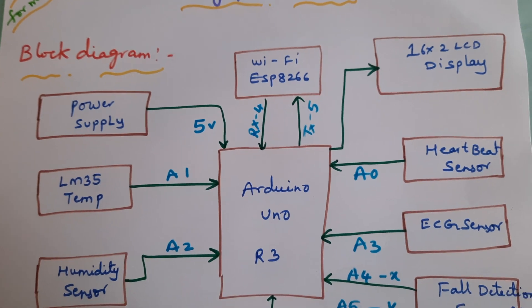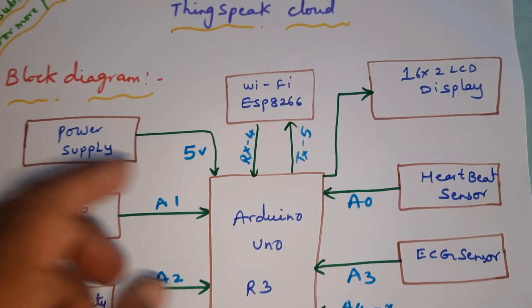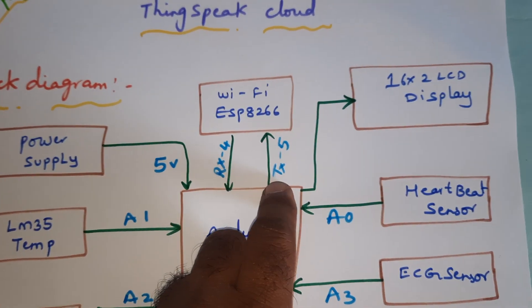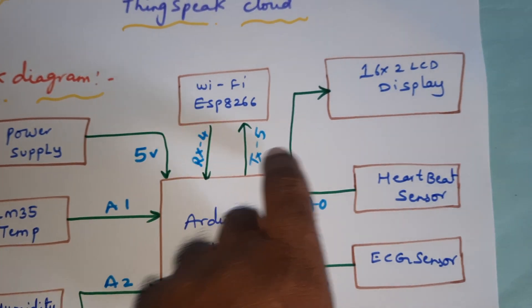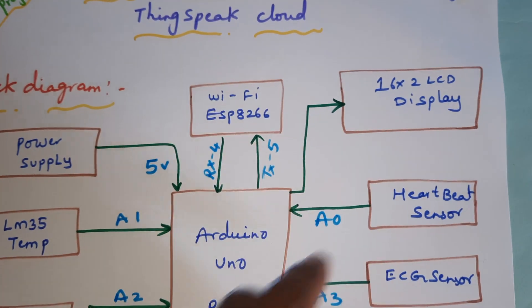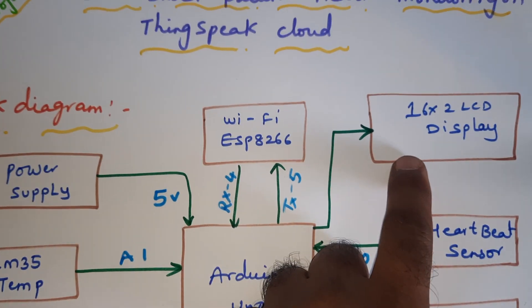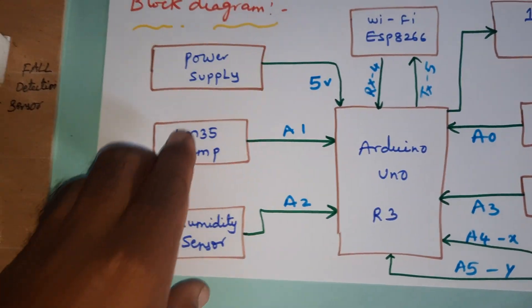The WiFi ESP8266 is connected to RX pin 4 and TX pin 5. The 16x2 LCD display is connected to RS, Enable, D4, D5, D6, D7 on pins 8 through 13.